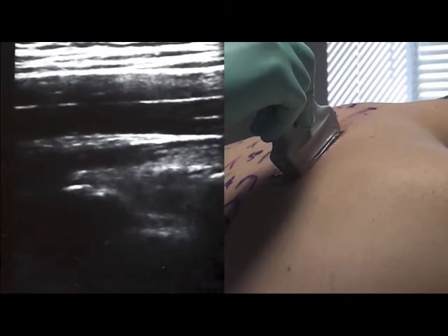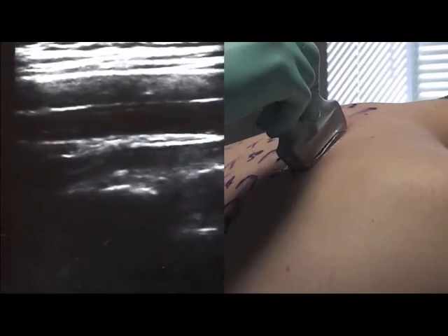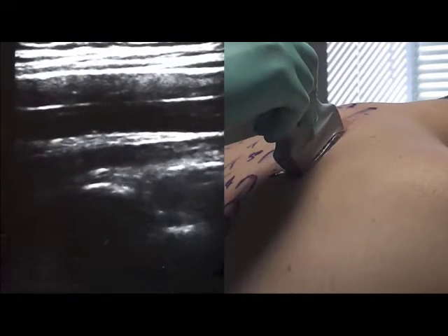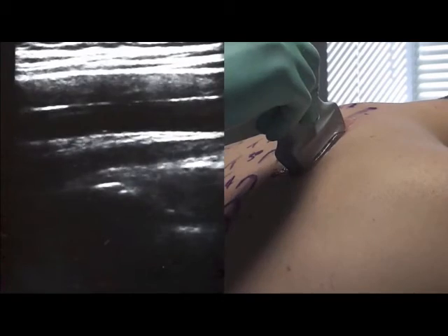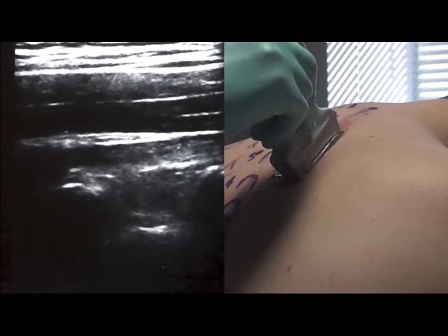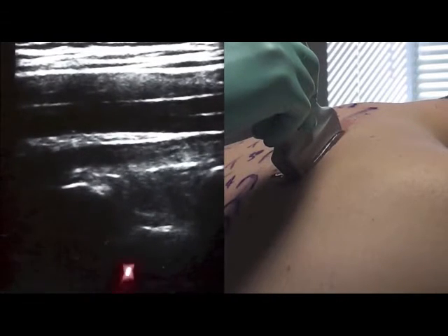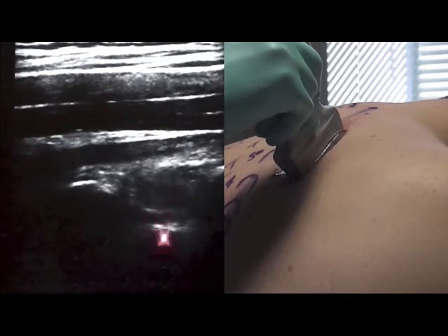We typically inject 15 mls at a single level, which achieves two to three dermatomes with that volume, and most of these patients also get a catheter. We thread it into the space approximately two centimeters beyond the tip of the needle. It's very characteristic when the needle is in the proper place — the paravertebral space — you'll see expansion of that space as fluid fills the potential space and pushes the pleura down.